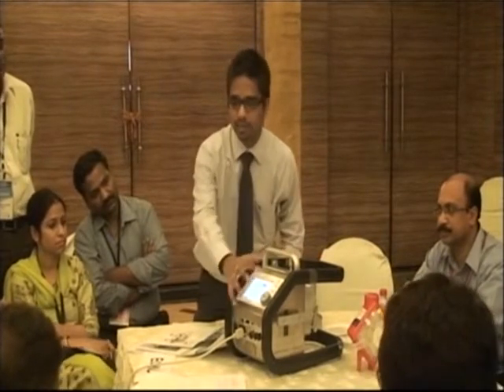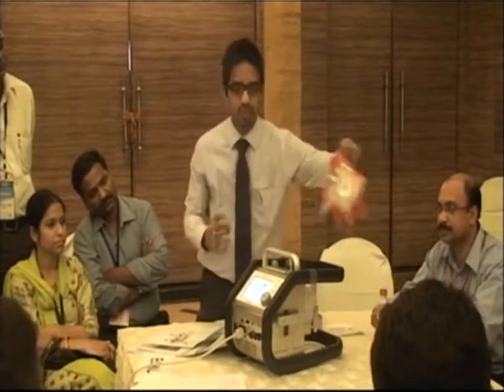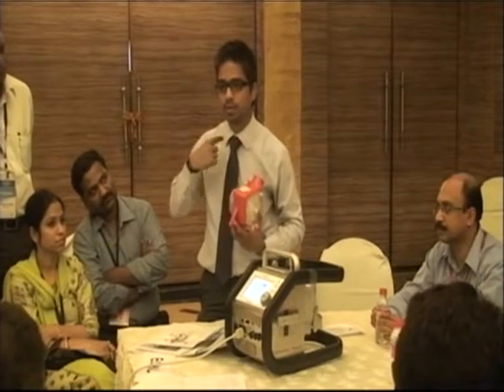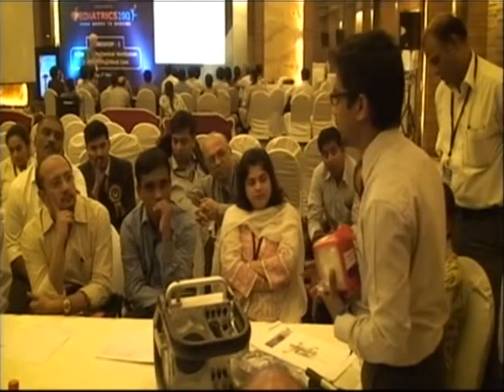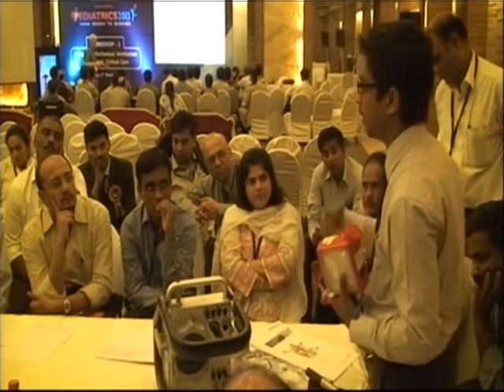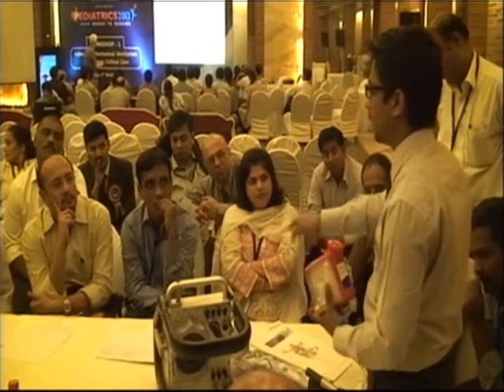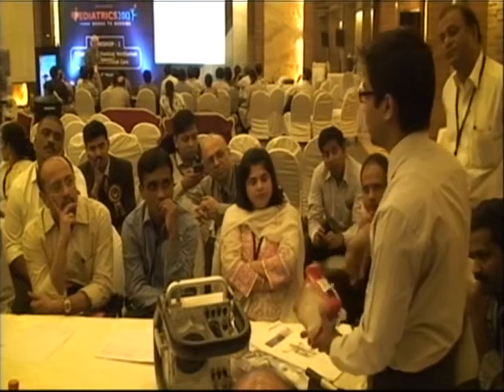And we get all the parameters monitored over here. There are special pressures which are very important for the oxygenator. So there is a pump, an oxygenator, a heat exchanger, and the tubing circuit. The tubings are connected by special tubing called cannulae into the patient. Depending on the mode or the need of the patient, if the lung is not working properly, if it is severe respiratory failure and the heart is alright, you may have to go for veno-venous ECMO, where we are concentrating on gas exchange only. So extracorporeal gas exchange happens, CO2 removal and oxygenation happen in this device itself, and the blood goes back into the patient.